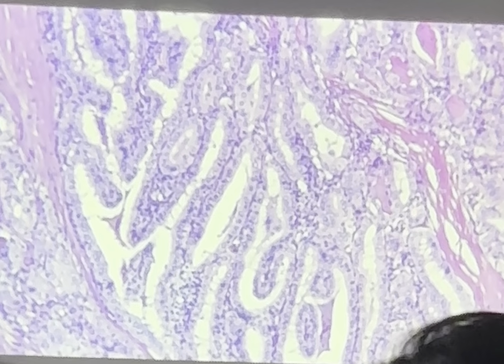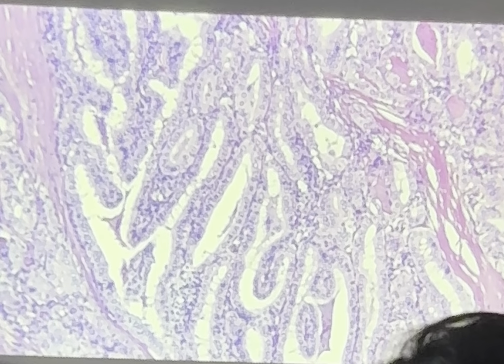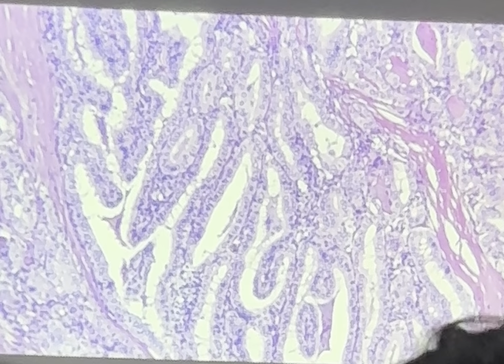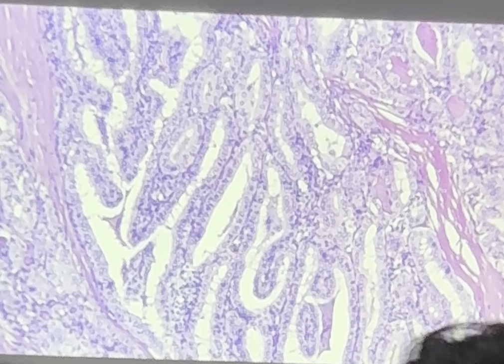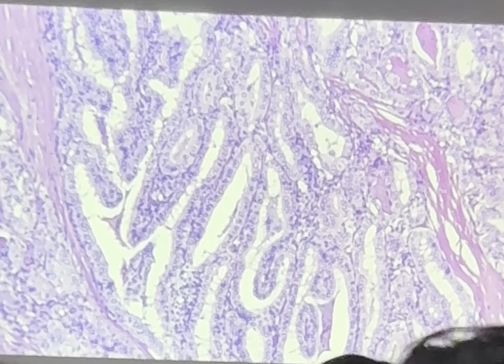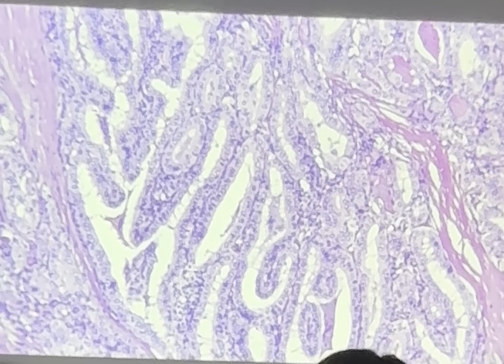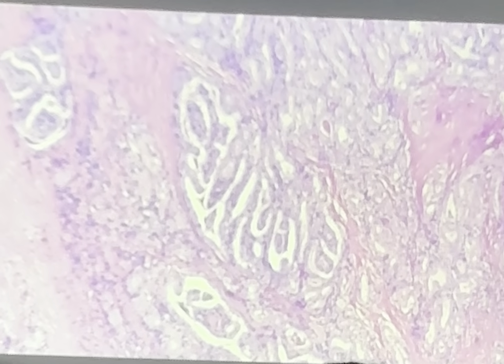But this tumor is an example of a moderately differentiated carcinoma. It's not well differentiated because it doesn't look like thyroid, right? But it's still forming recognizable structures. In this case, it's forming a papillary structure. So it's still a moderately differentiated type of carcinoma. That's papillary thyroid cancer.